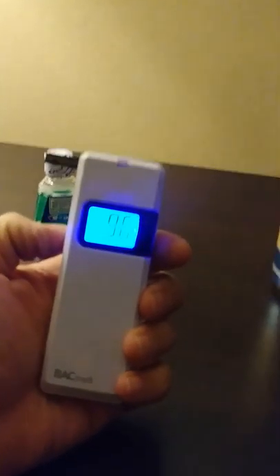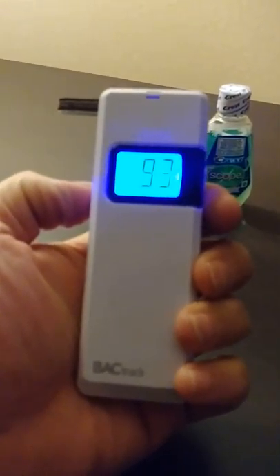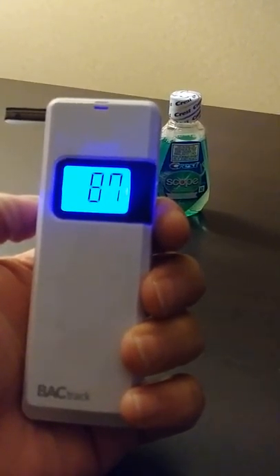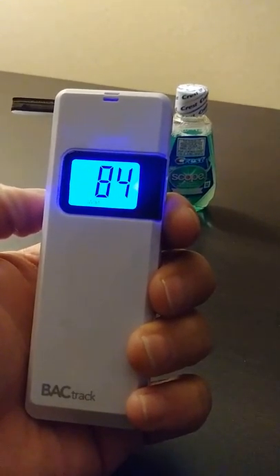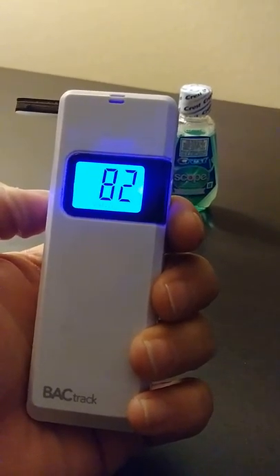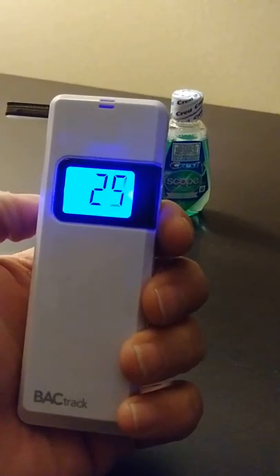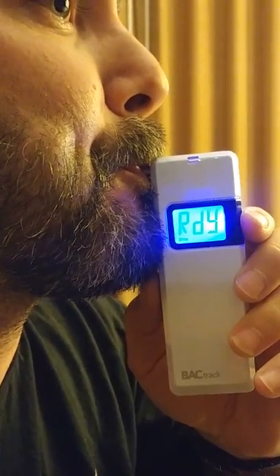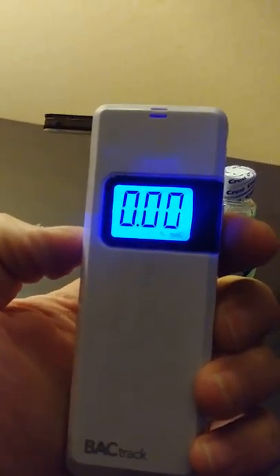I'm going to try my mango drink to rinse out my mouth and see if that clears it. Back to the breathalyzer — as you can see: 0.00.